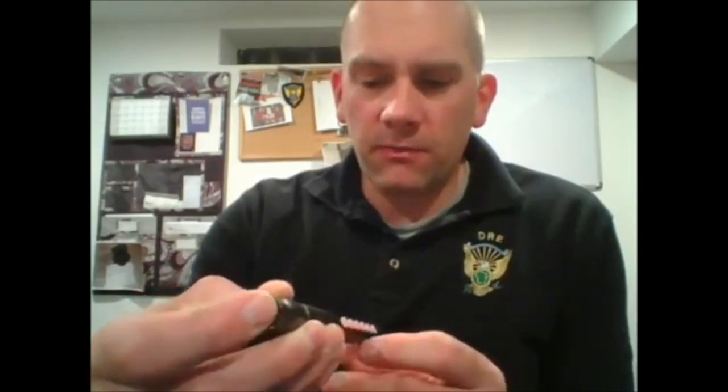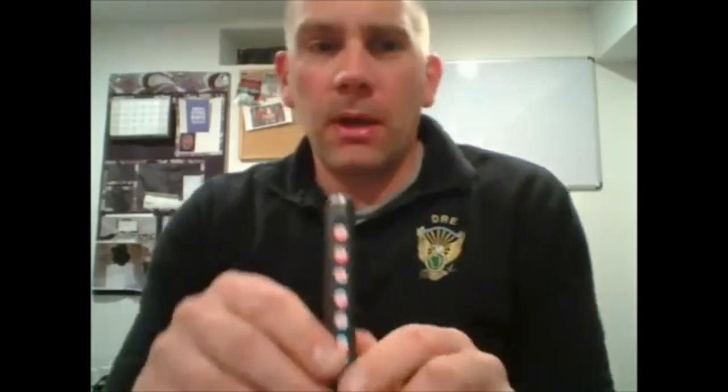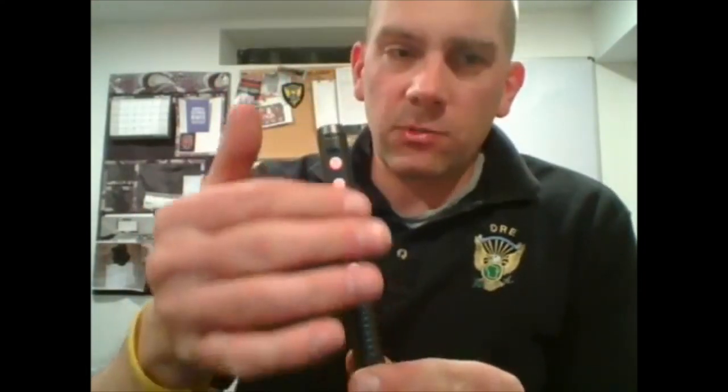This is a lot different than your usual pen light, where you hit the button, the light comes on, and that's all there is to it. This has some features to it. The on/off switch is here, and what it does is it turns on these LED lights up at the end. There are six buttons on the front.